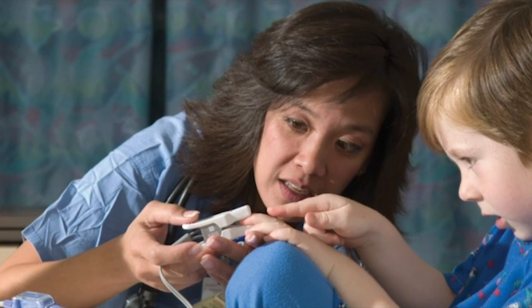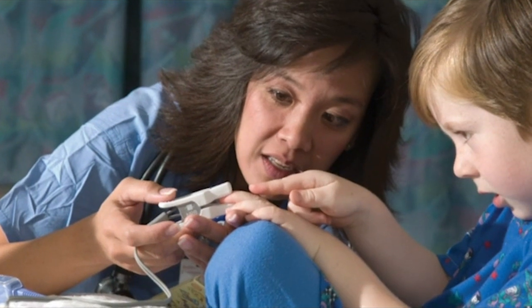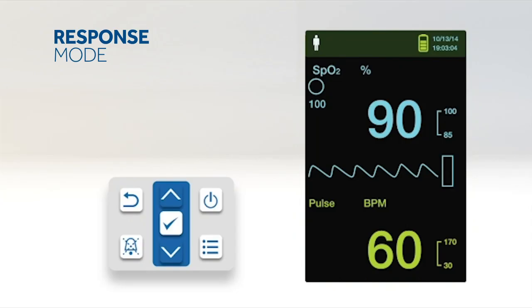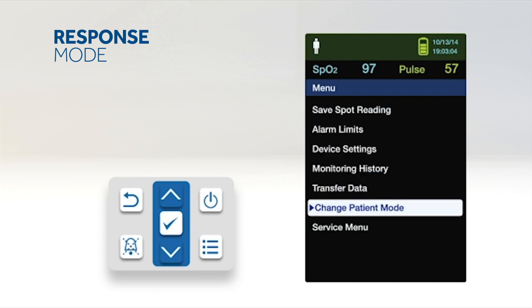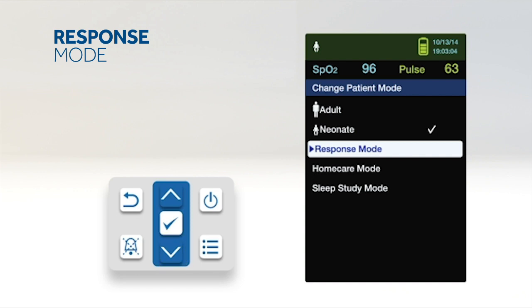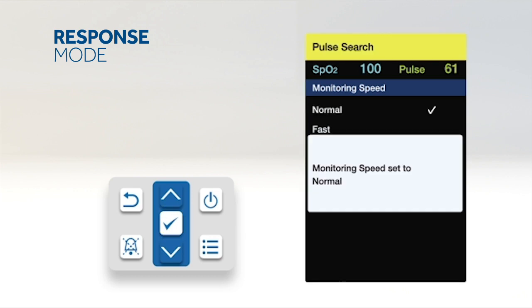The monitor has the added functionality of response mode, home care mode, and sleep study mode for simplified monitoring in hospital and home settings. Response mode establishes the rate that the monitoring system responds to changes in SpO2 readings. To set response mode, access the change patient mode menu, press up or down to highlight response mode, then press OK to select. Press up or down to highlight normal or fast, then press OK to confirm. When set to normal, changes are reported within 5 to 7 seconds; when set to fast, within 2 to 4 seconds.